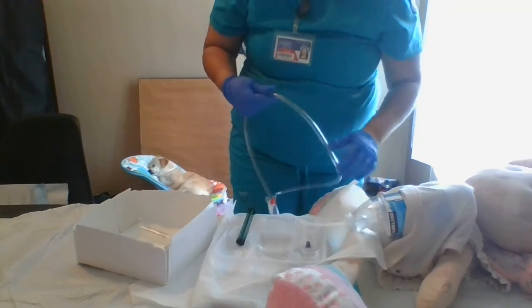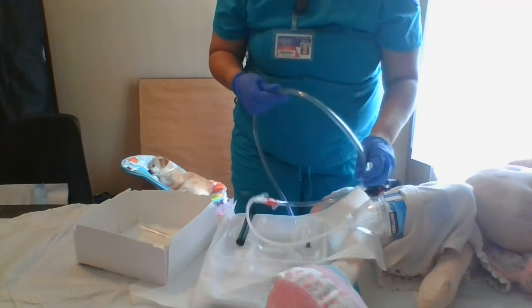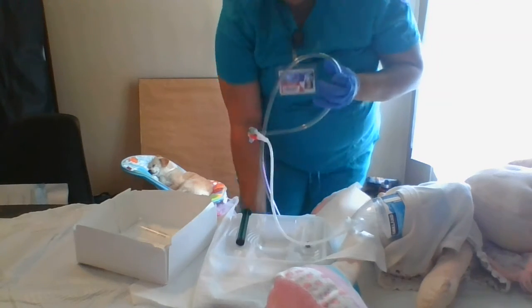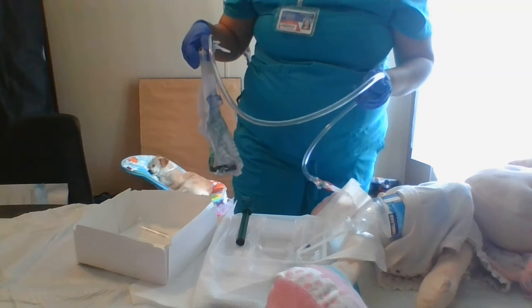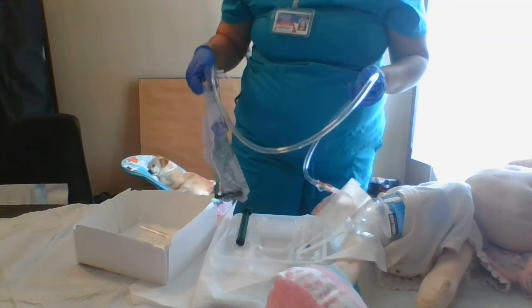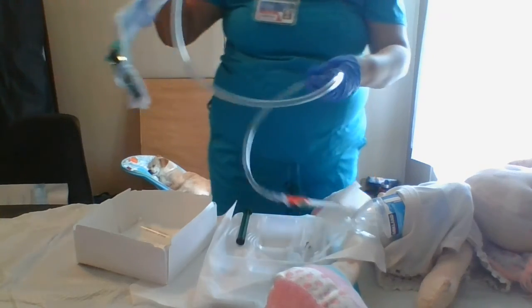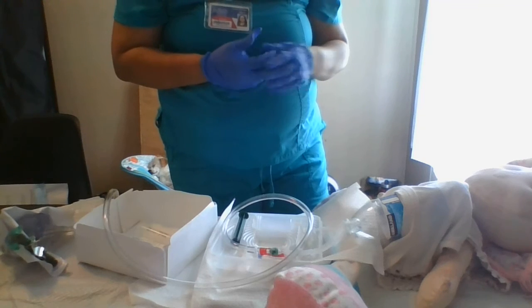Now I will tape my catheter to the inside part of the leg of my patient, and I will attach my catheter bag to a non-movable part of the bed. Okay, we're all done now.